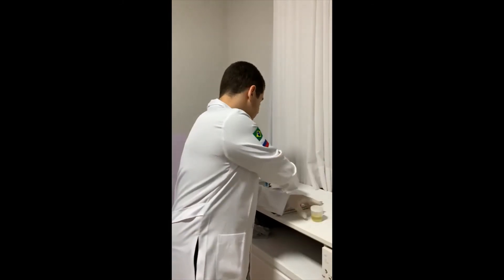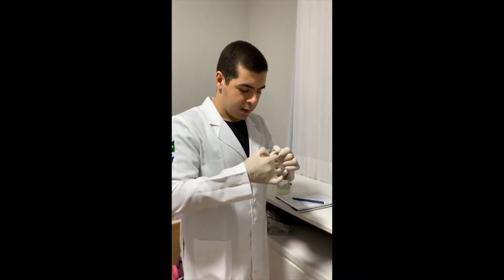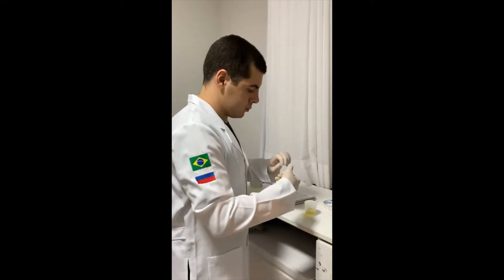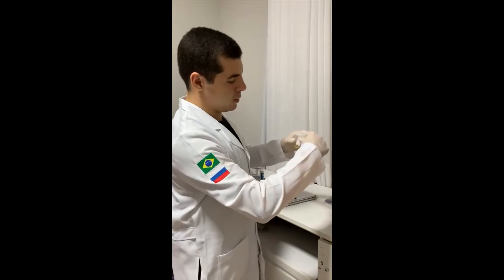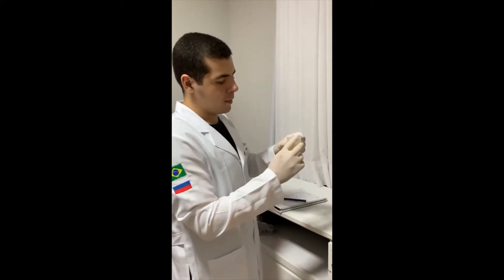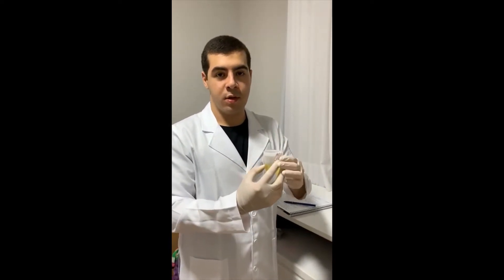After that, we will write the information on a label, put it on the specimen container like that, and leave it to the laboratory to be examined.